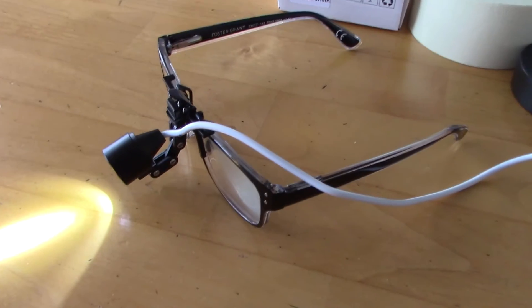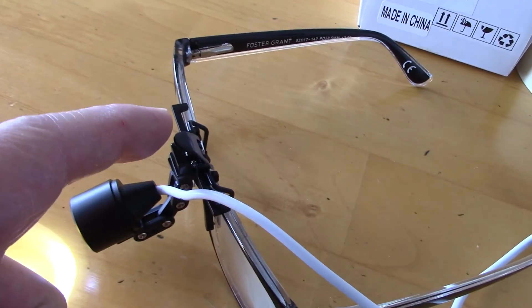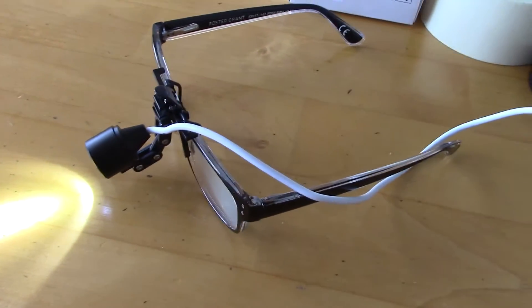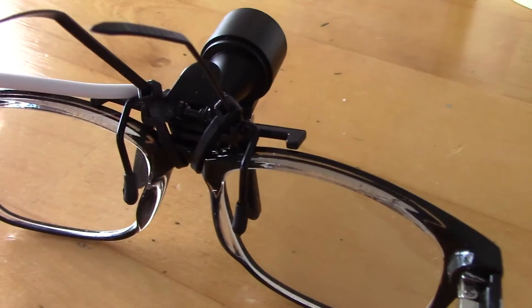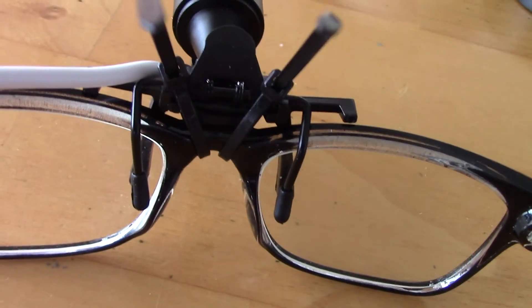I have attached the light to my glasses and it's on right now. Here's the cord and battery. What I intend to do is use zip ties to fix it to the frame of the glass, and then use superglue to glue it to the earpiece. I use the 4-inch zip tie to fix the light to the frame, as you can see right here.